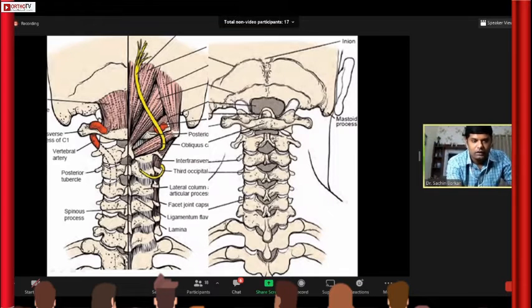And coming to the relevant anatomy, what all structures are important here are actually the most dreaded is the vertebral artery, and where the vertebral artery actually runs in front of the lateral masses. So if you tend to put a screw straight ahead, here you may go into the foramen transversarium. So we'll see it in the next slide in the axial section where actually it is.